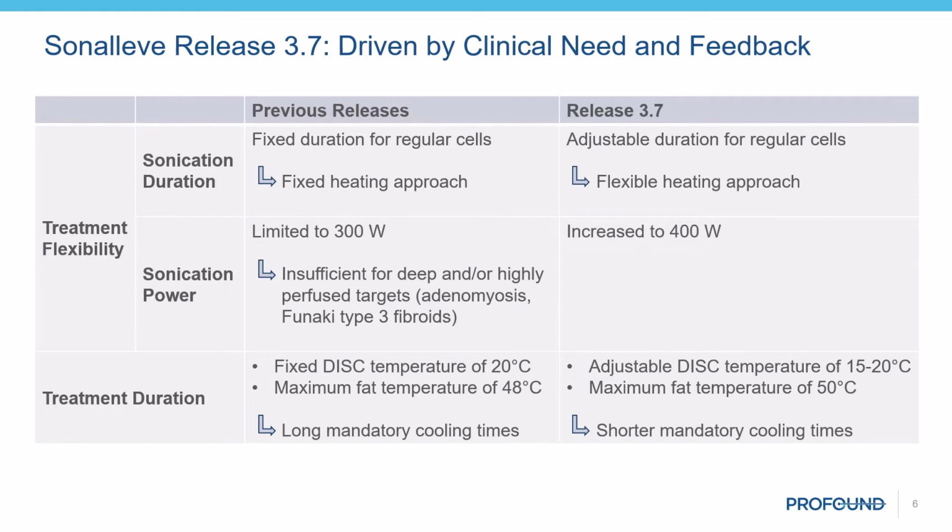Furthermore, treatments of large target volumes have been reported to take up to several hours, with the main contributor not being the actual sonication time, but rather the long mandatory cooling times between sonications. The mandatory cooling times relate to the maximum temperature limit of 48 degrees Celsius imposed on the subcutaneous fat layer. Thus, the maximum fat temperature limit was increased to 50 degrees Celsius in Release 3.7 to shorten the cooling times.